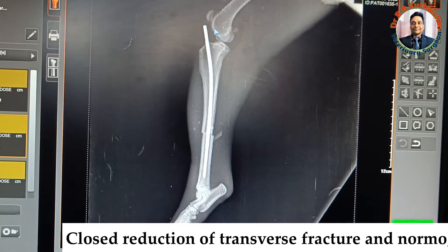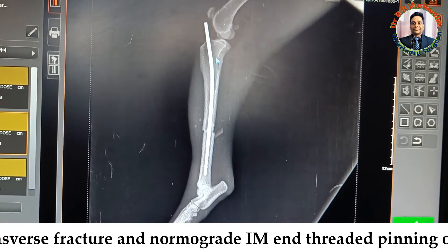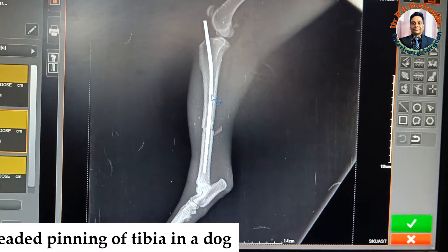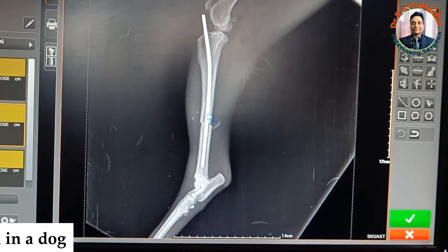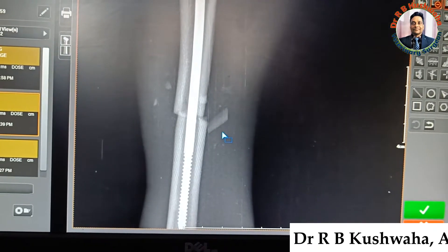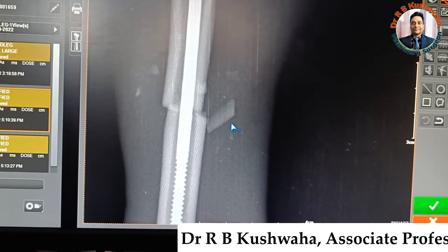You could see this pin — how this pin took the contour of the bone. That is why it bent slightly here and then took the shape of the intramedullary cavity. And you can see here how beautifully the reduction is in this particular case.